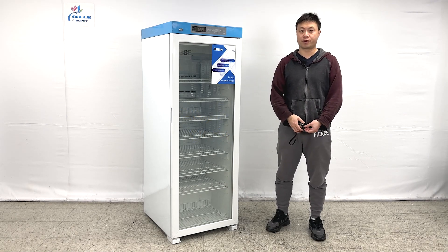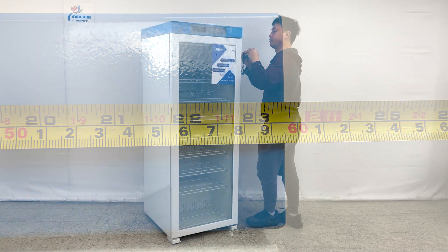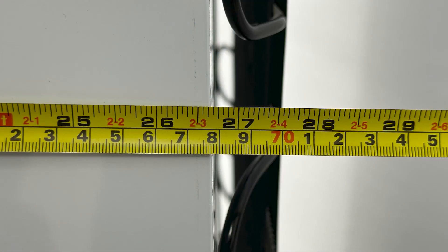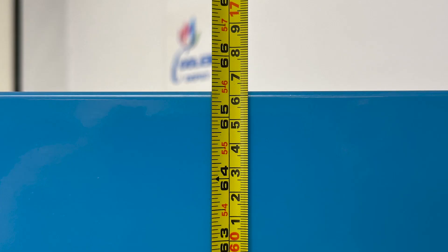Let me give the overall dimensions first. The unit's entire length is about 23 and a half inches wide, and the overall depth of the unit is about 27 and a half inches deep. The overall height of the unit is about 65 and a half inches tall.